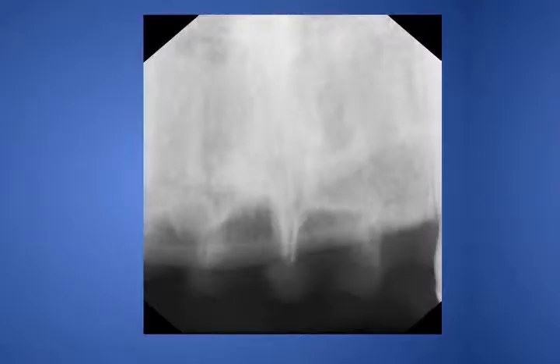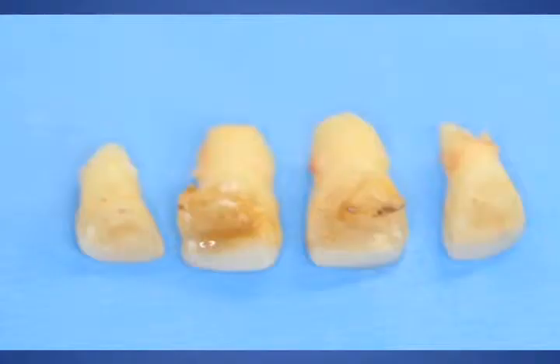Interdental papilla, trying to maintain those triangles as much as possible, is a critical part in the final aesthetics for this patient. Here the radiograph illustrates the extraction sockets, and again you can see that they are relatively shallow and they will be obliterated in the final osteotomies. The septal bone is maintained in this situation. It's critical that we maintain that septal bone so that we can maintain tissue height and keep the nice interdental triangles as possible.